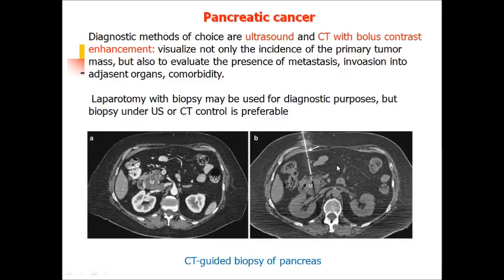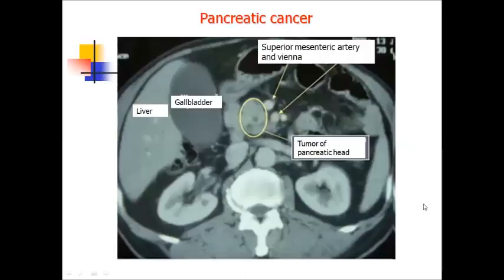Here you see that a fine needle was injected into tumor lesion, into pancreatic head in this case, and a sample will be taken for cytological or morphological examination without operation. A very fine and very informative and reliable technique.